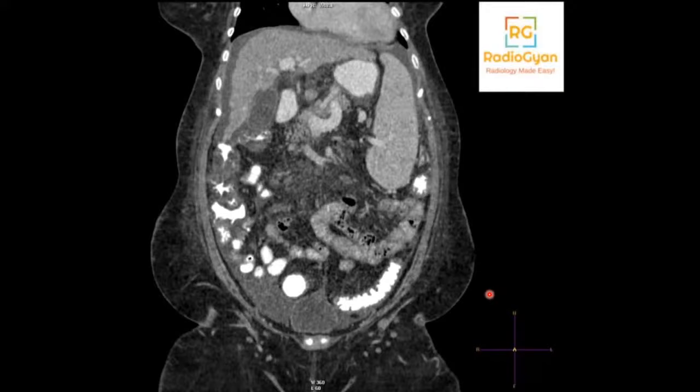Okay, liver cirrhosis and portal hypertension. Okay, okay. Dr. Marwa, I think, yeah, you got the first part right. So what we see is a nodular contour of the liver. There is splenomegaly, there is ascites. So these three findings together constitute portal hypertension. So that's right. But additionally, what we see is that the ascending colon is thickened. So that is what is portal colopathy.